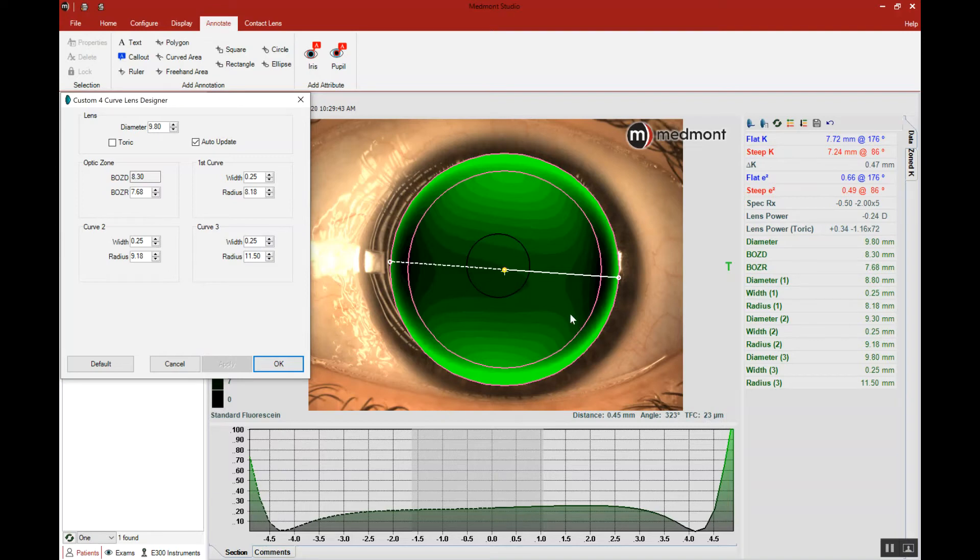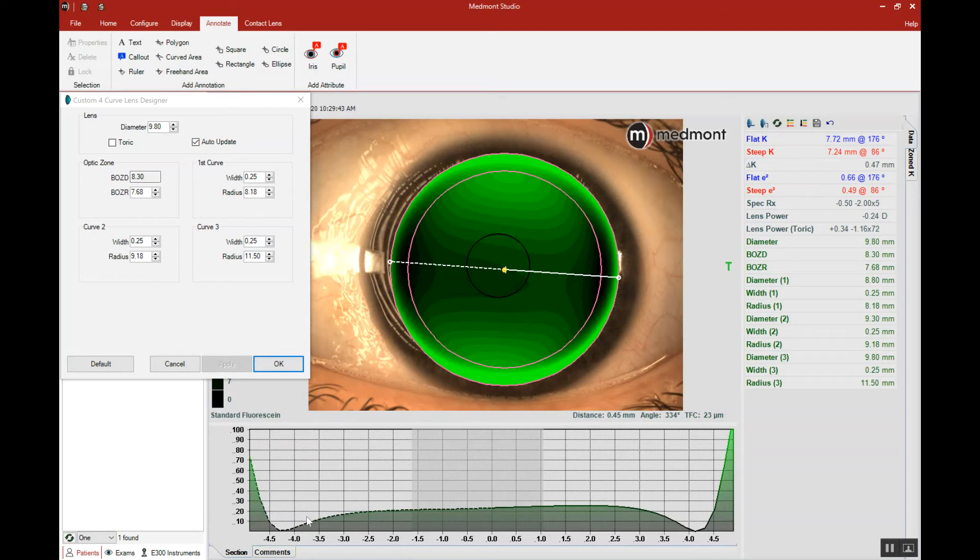That's certainly within our range of 20 to 25. So our lens clears the corneal apex with that 20 plus microns of fluid, and that allows it to land in the mid periphery.